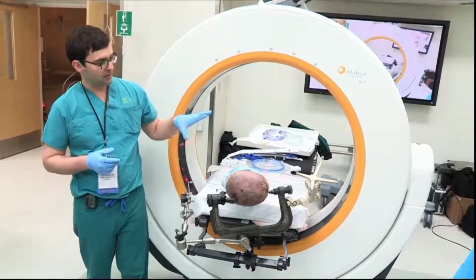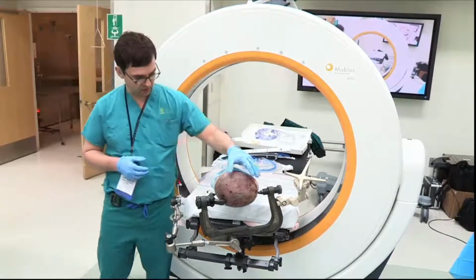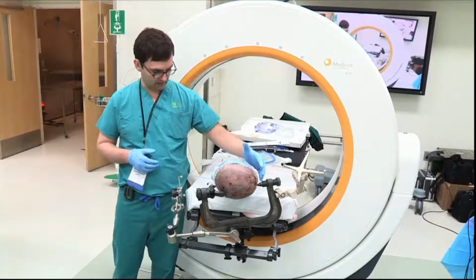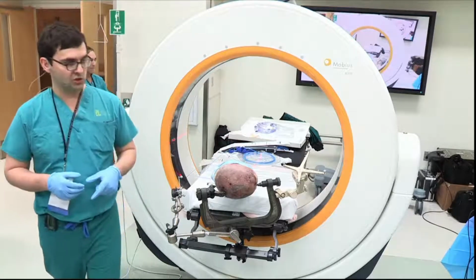We place the patient supine with a bump over the shoulder of whatever side we're going to be treating. So just to orient you guys, this is the parietal occipital area on the left side, and this is the face here. So we've already done a CT scan. After the CT is performed, we want to check that accuracy.